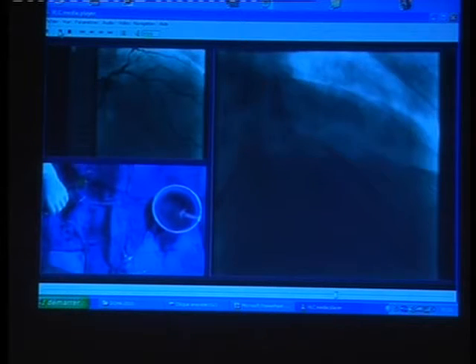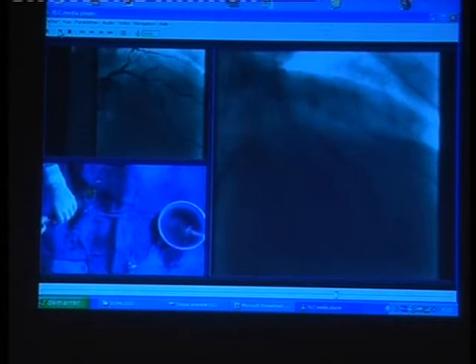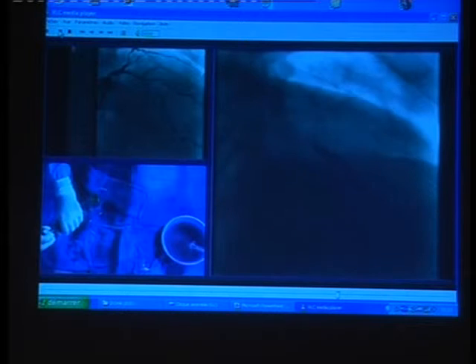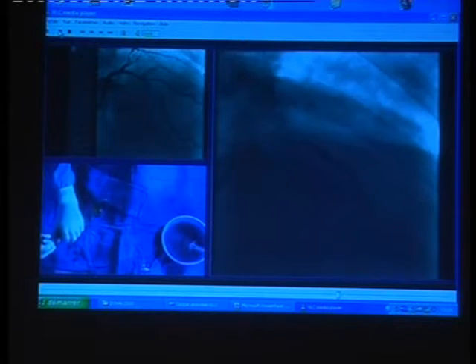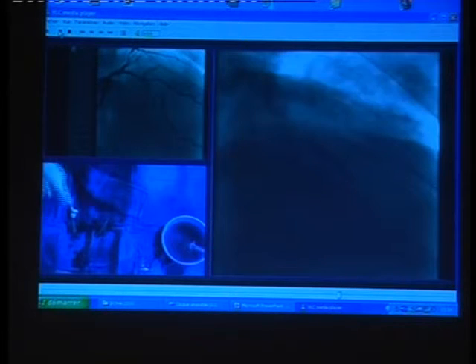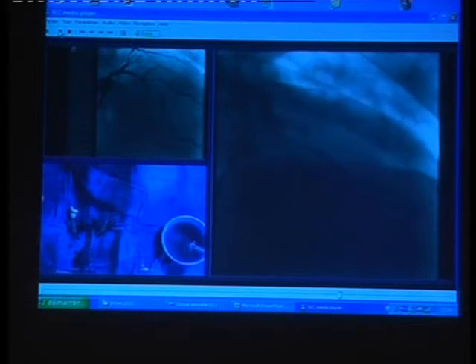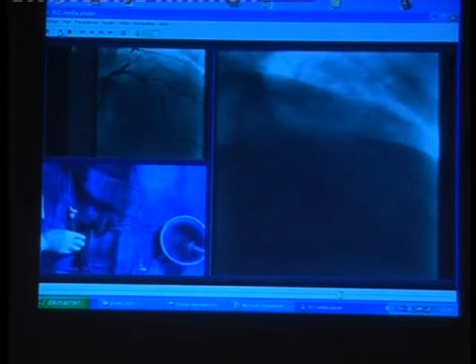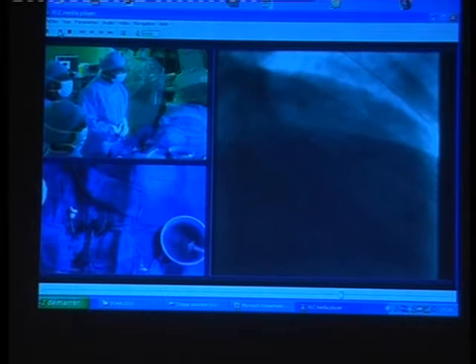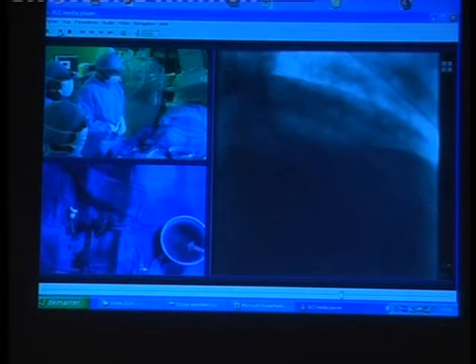It's certainly interesting, after the angio control, maybe to evaluate by IVUS the ostium of the diagonal, if the ostium is free or covered by the strut. We can also do a stent boost to evaluate apposition. I inflate up to 16 atmospheres. And if they are ready, we can perform the stent boost now.